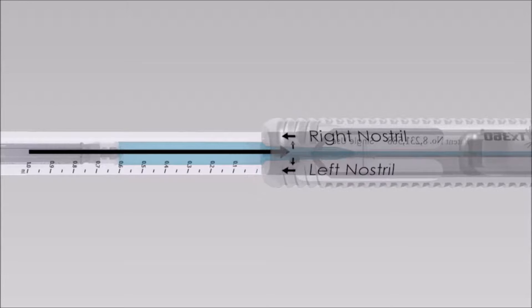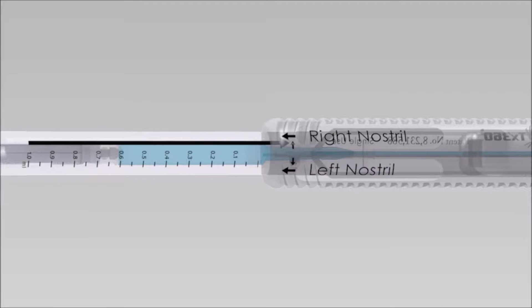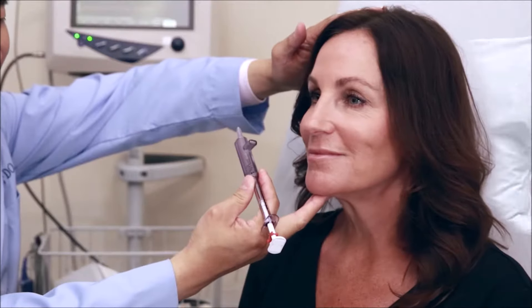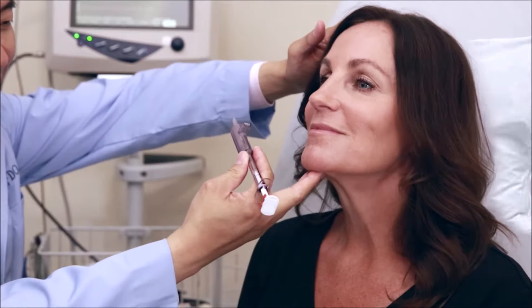Choose the right or left nostril to start. I will start with the patient's right nostril. Align TX360 to the right nostril by turning the syringe counterclockwise so that it is on the right nostril track. Always keep the handle pointing at 12 o'clock. Please stand in front of the patient.